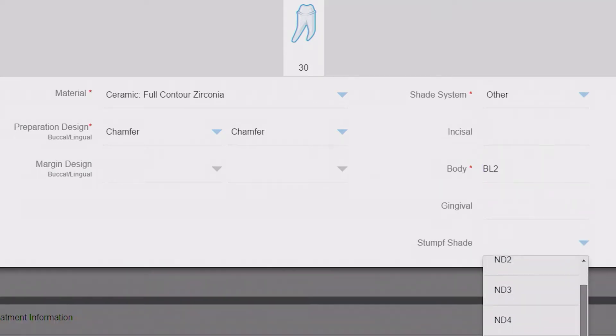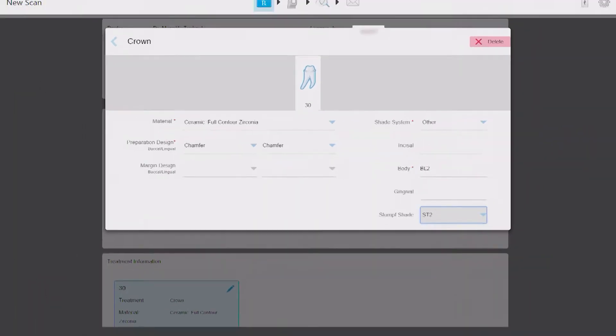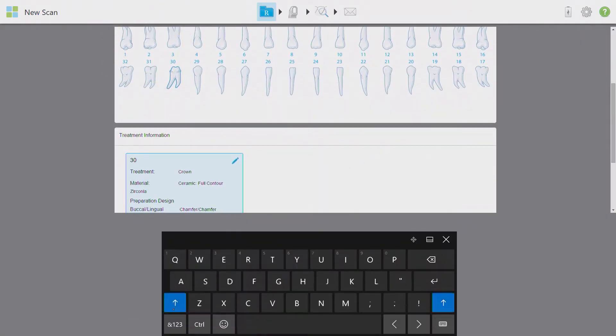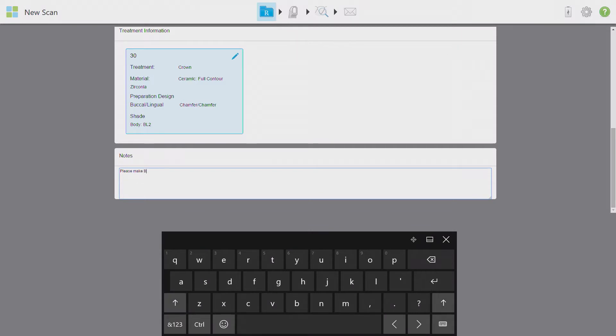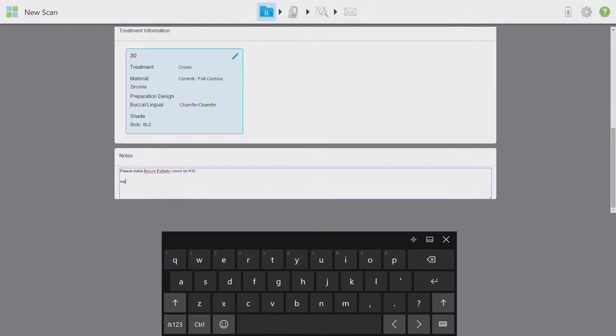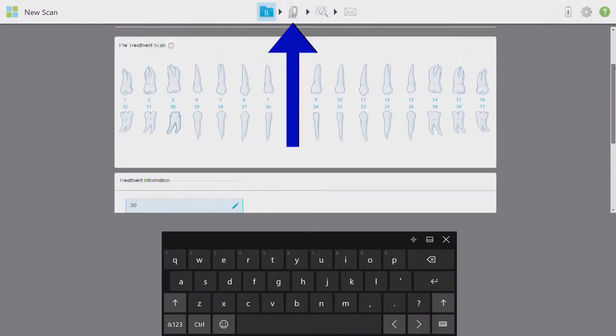Don't forget to take and enter the stump shade, especially for restorations that aren't fused to metal copings — there is never such a thing as providing too much information. Press the back button once all entries are complete, then enter any specific notes in the notes section before moving forward. This is your chance to specify the exact product as well as any unique instructions the lab needs to know. Even if this case is being sent to your own chairside mill, enter all of these details so you can refer back to them later.